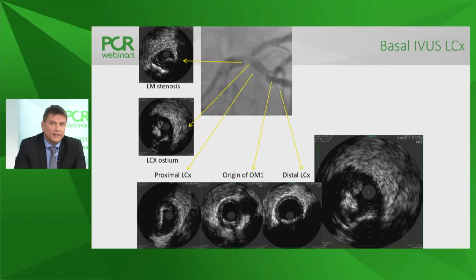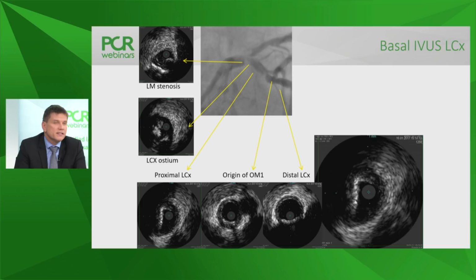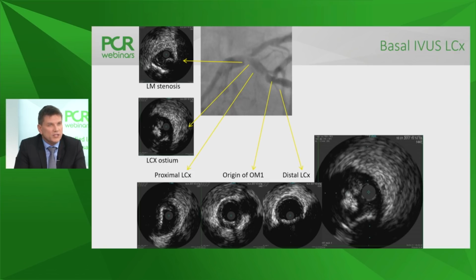Christoph, in your practice, what is your position about using imaging in this setting? Well, I already said, if I have a precise question, and here I had enough questions, it is something that I think we should use. If you have no questions, I'm not using it in every case. And in particular, in this case, there's no really new information from imaging, but the imaging really confirms what we have thought from the angio. So now we know that our analysis was correct.